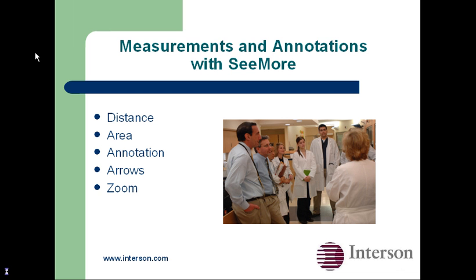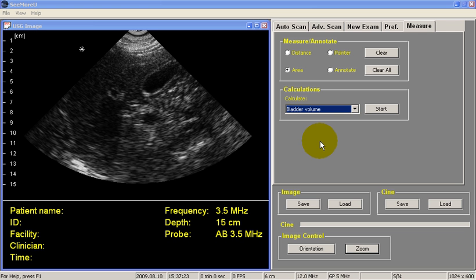Let's talk a little about measurements and annotations with SeeMore software. The first thing is you need to freeze an image, and then let's select Distance by left-clicking on the Distance button.